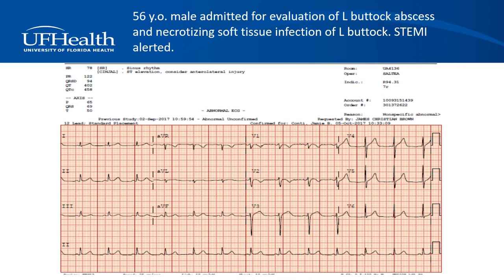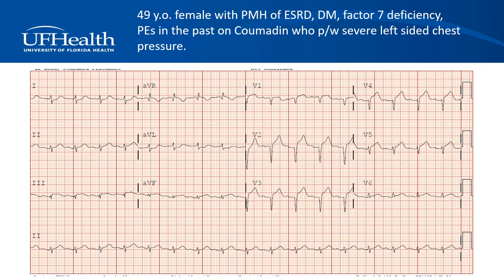This patient does have ST elevation in lead V3 and a small amount of ST elevation in lead V4, but it is less than 2 millimeters and therefore does not meet STEMI criteria. Therefore, the STEMI alert was canceled.